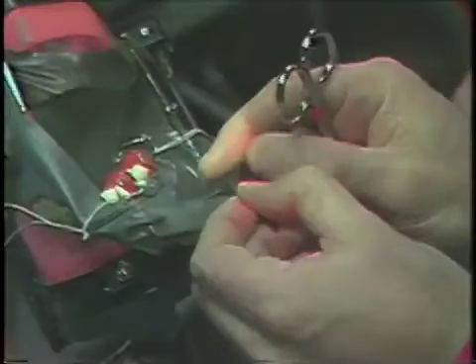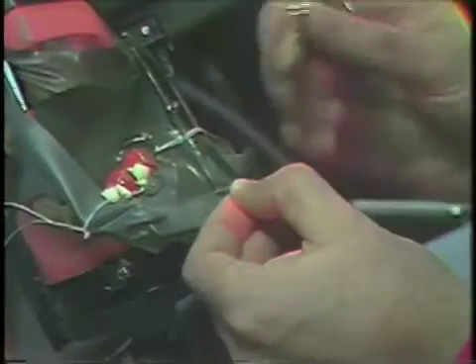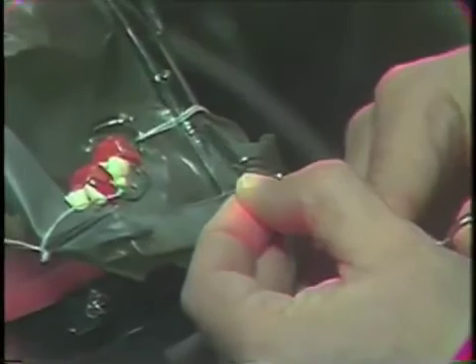After the one end has been contoured appropriately, we turn our matrix around and then carefully on the scored area, once again trim in a semi-circle.